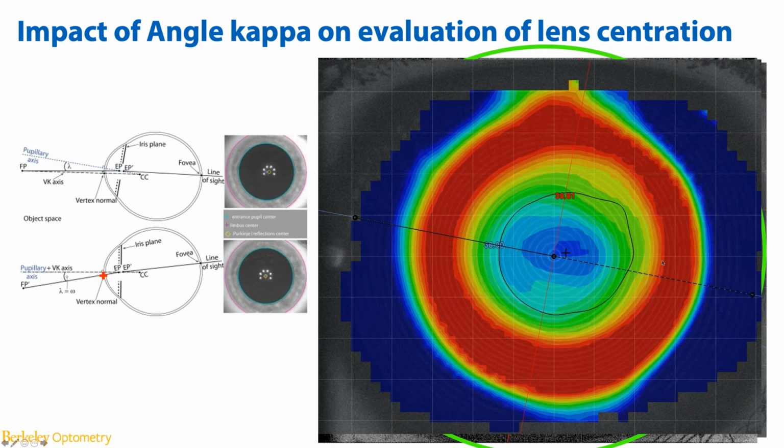So the eccentricity, the width, and the magnitude, all 3 of them are, at least in animal studies, playing a role in terms of the overall anti-myopia efficacy. Currently, we don't actually know what's the best combination. But I do want to say that striving to achieve a smaller treatment zone at a significant cost of losing visual performance, especially in dawn and dusk or nighttime glare, is probably not fully supported based on the evidence we have so far.